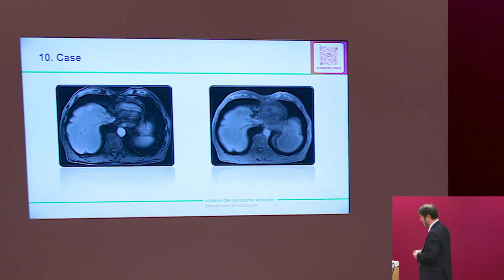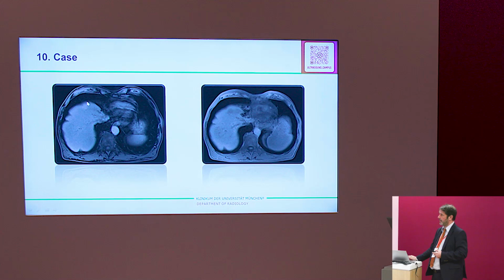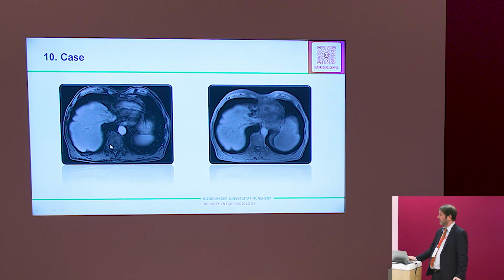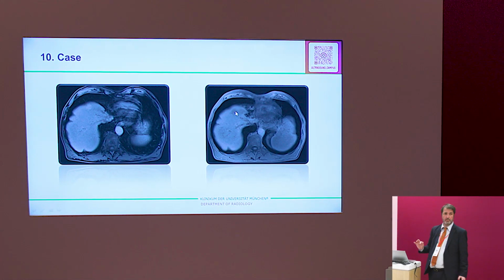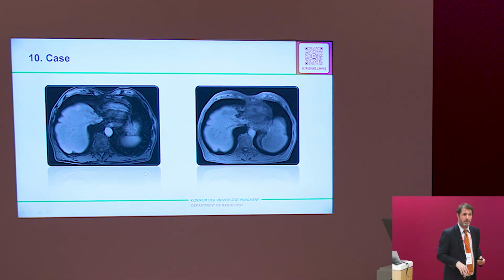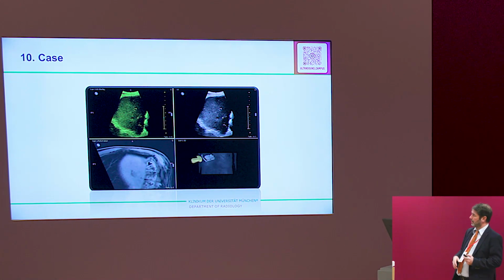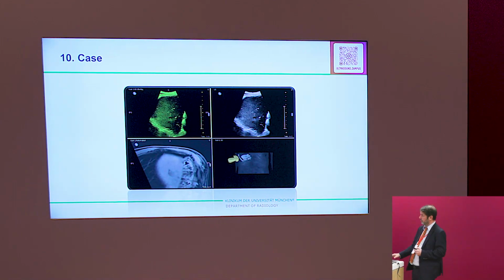You see very nicely, in the MRI there's a lesion here, which shows a strong uptake, and later it seems to be dark. So if you only have these 2 images in the MRI, your diagnosis will be mets. So you see, we use the MRI for fusion.